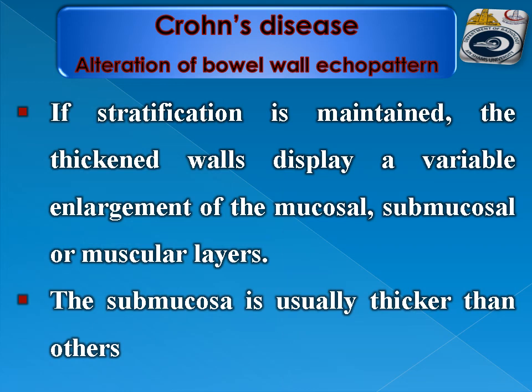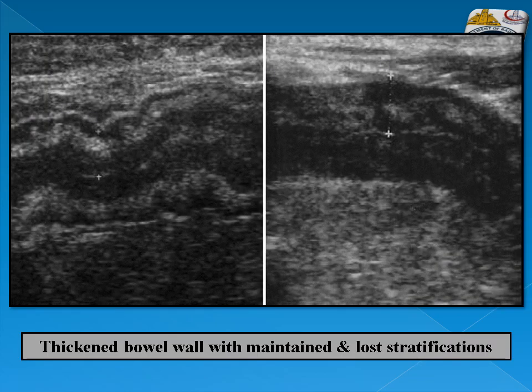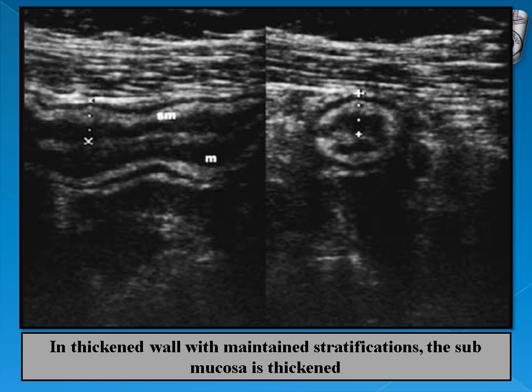Alteration of bowel wall echo pattern: if stratification is maintained, the thickened walls display variable enlargement of the mucosal, submucosal, or muscle layers. The submucosa is usually thicker than the others. Examples show thickened bowel wall with maintained stratification or layering of the wall, and another example with nearly lost stratification especially in the far wall. The submucosa — the hyperechoic layer — is thickened more than the other layers.